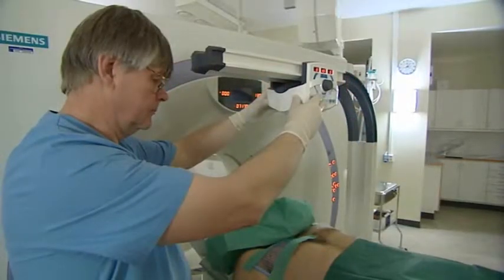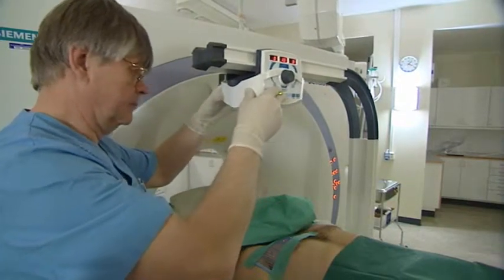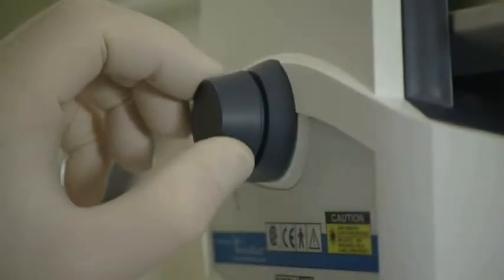The SimpliCT's pointing laser will angle out to the set angle, and by moving the laser unit, the laser dot should be brought towards the skin entry point and placed directly superimposing it. For small adjustment, use the fine-tuning wheel at the rear of the laser unit.